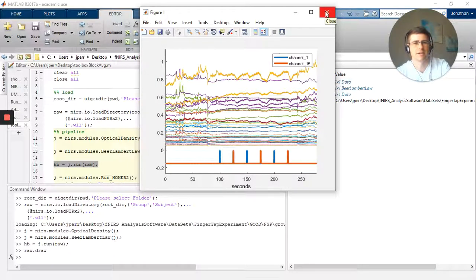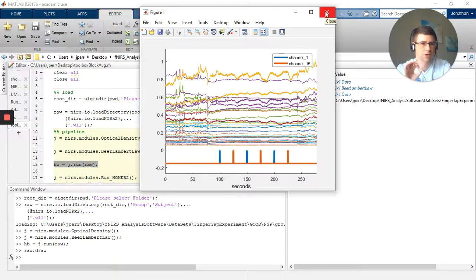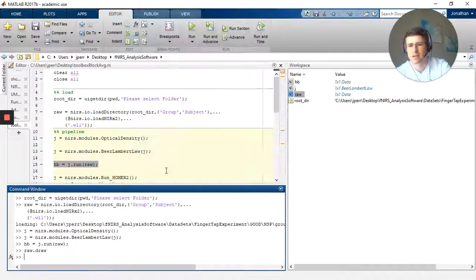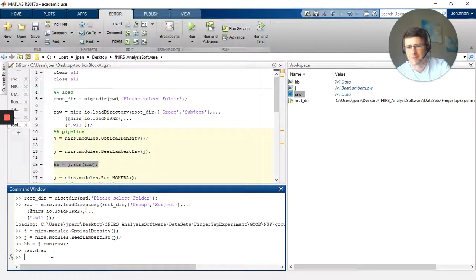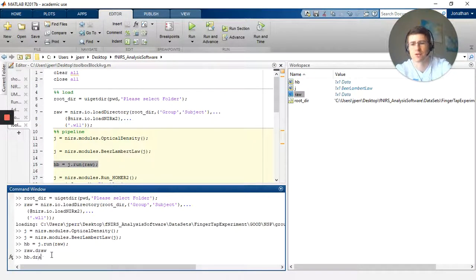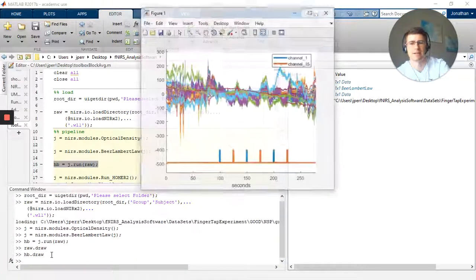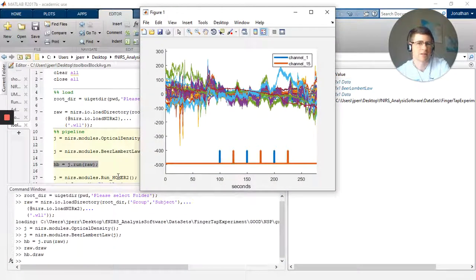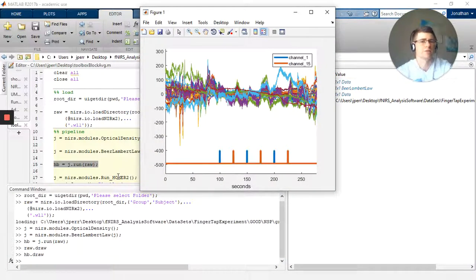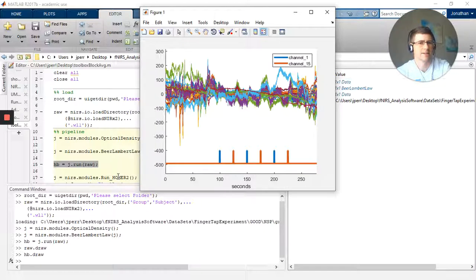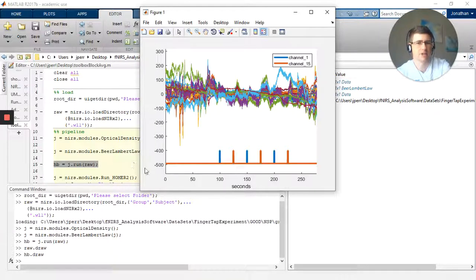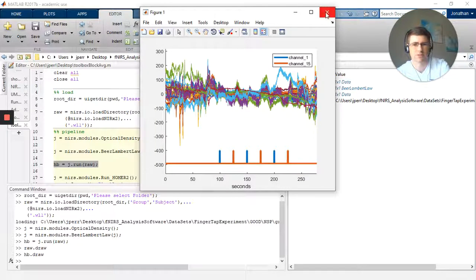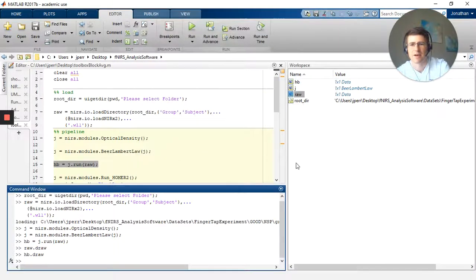So you close that, and then now I can do hb.draw, and now I can see the change. So at this point I can see it went from voltage to relative changes in hemoglobin. And then you still have these trigger points, trigger values.